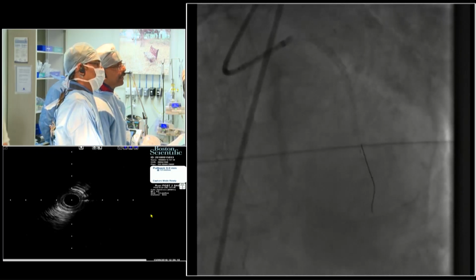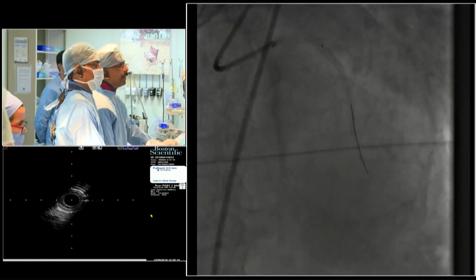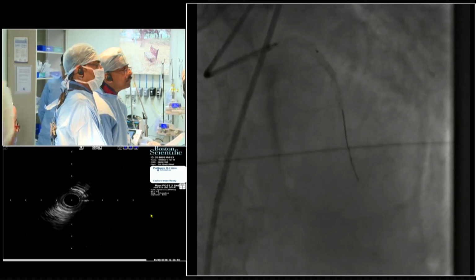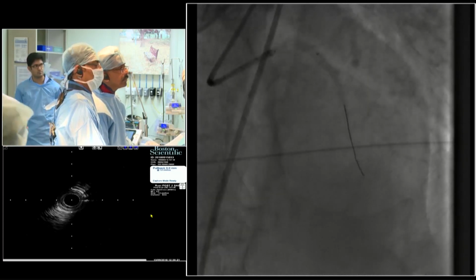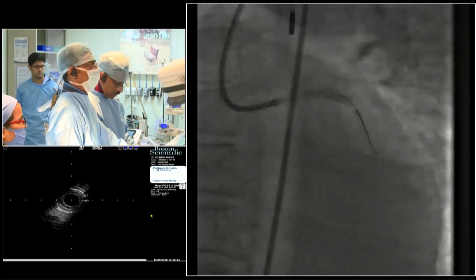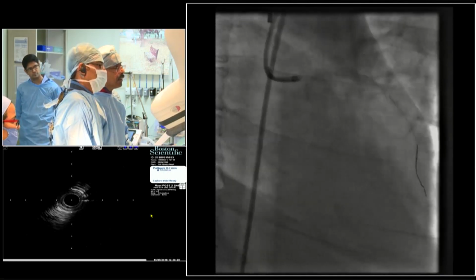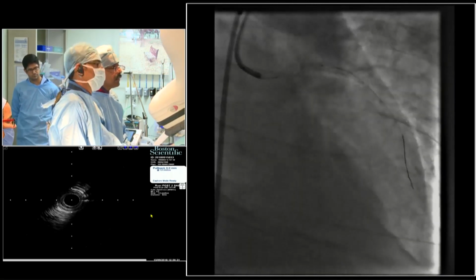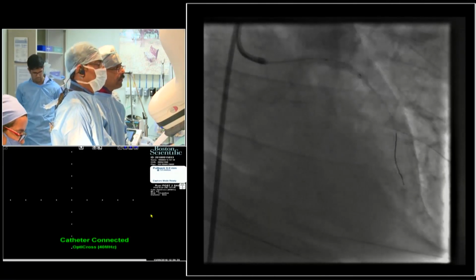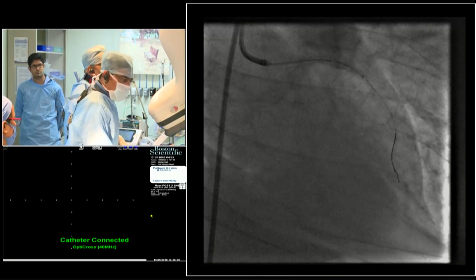You really want to focus on the left main. Okay, slowly, sir. Slowly. Come to caudal view, please. This is the other problem here. We'll have to always watch, because it's a calcium, lot of wire bias and resistance. Maybe if it doesn't go. Okay, here we go. So you have to loosen the guiding. Don't deep throat the guiding when you have this problem.